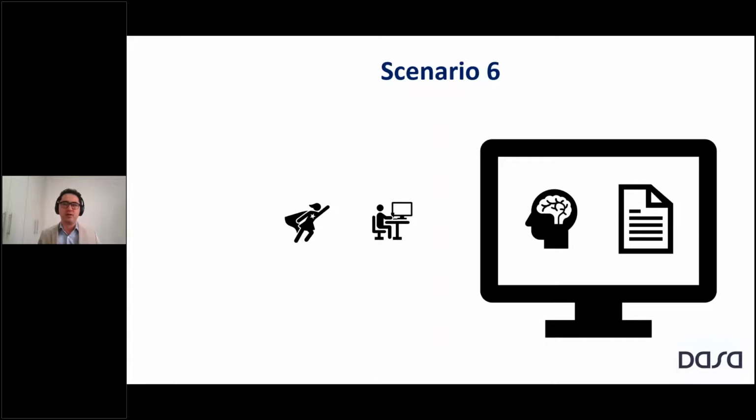And maybe the last possibility would be, I don't ask for AI results. I'm reporting the studies in my work list, and then I have an AI model finding some study in the past that has a critical finding, and this AI will nudge me to read that study next. The reason I've shown Clippy here, an old Windows 95 app that used to nudge us in terms of what we should do: what we do want is to prioritize urgent cases. What we do not want is being interrupted all the time with a lot of false positives.